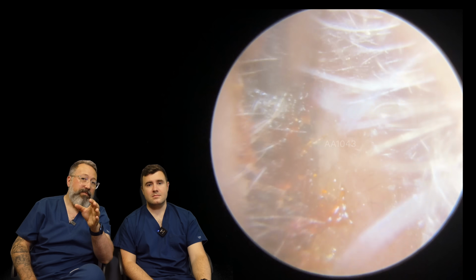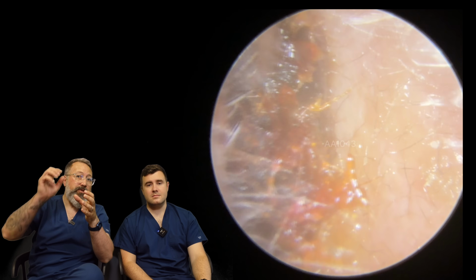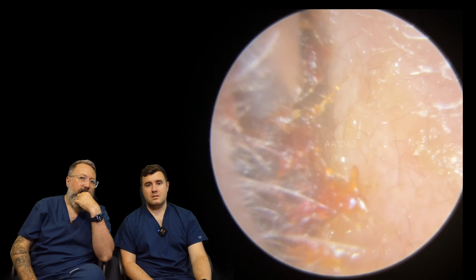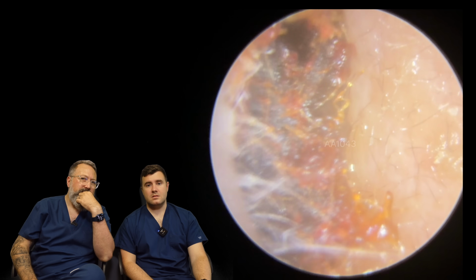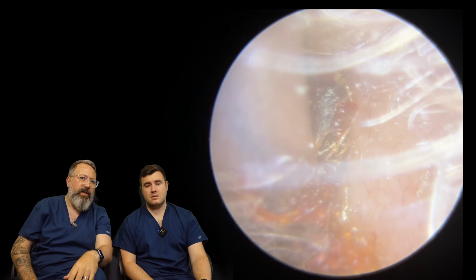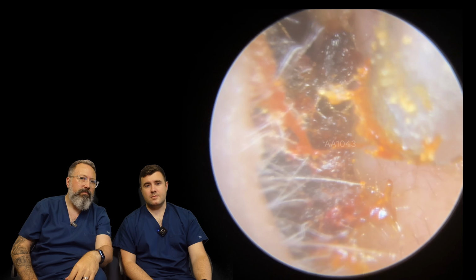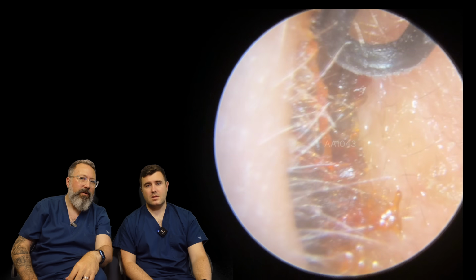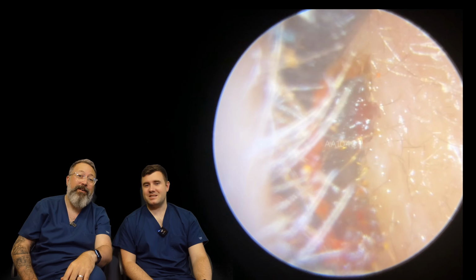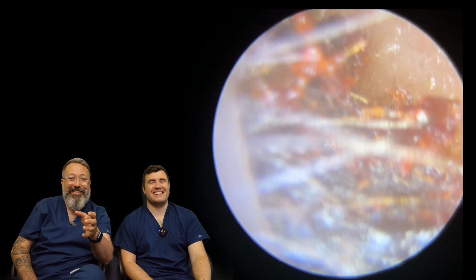Sometimes I'll go in at this point with the Jobson Horne and just nip over the top, scoop into it and pull that away. I can't remember whether I do that in this one. I think I don't, because it starts breaking down and starts to come away a little bit more easily. No, there we go, we've got a little gap. Oh no, there we are. There's a Jobson Horne. So it's coming away really well.